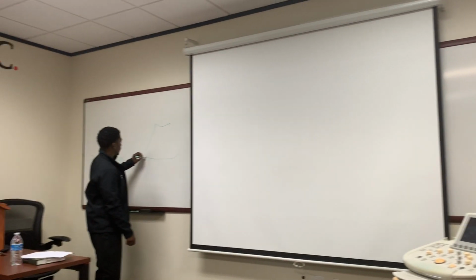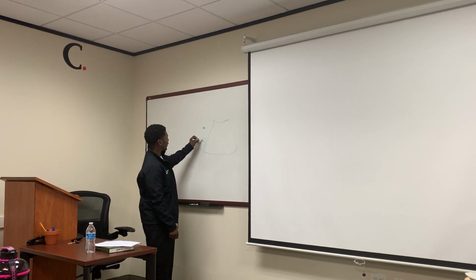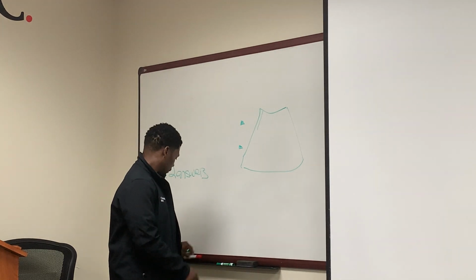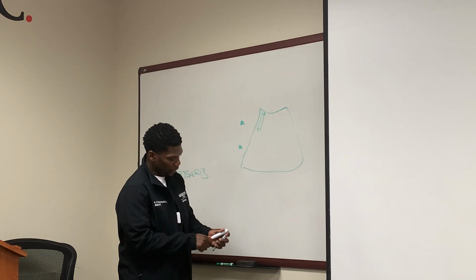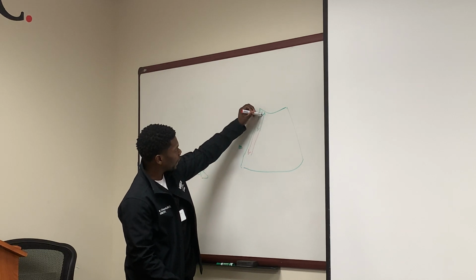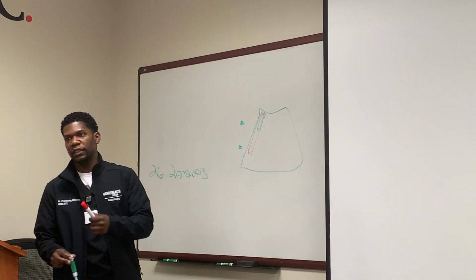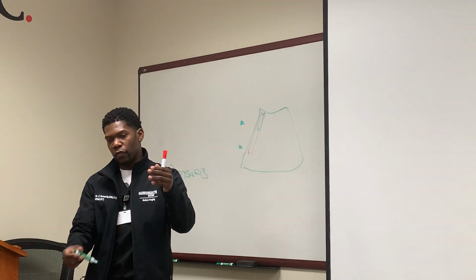Here's my 1 focus right there, and 1 focus right here. Instead of it just sending out one pulse, that's 1 scan line, it also has to go and return down that scan line, and also send out down that same scan line, go all the way down here, and return back down that 1 scan line. That decreases the temporal resolution because now I'm taking more time to create this 1 image, just because I want more lateral resolution. I want my beam to be thinner over a particular depth.